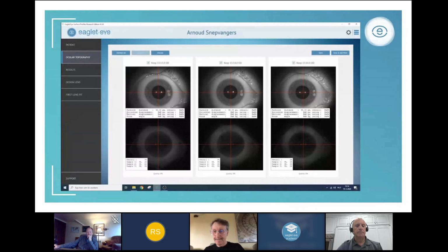Stephen Matthews asks, any indication about scleral molding from the fingers? I would say none at all, because we recommend using the orbital bone. So you grab the eyelashes and you really pull them down to the orbital bone. And at the moment that you start touching the eyeball, the sclera, the patient is moving back anyway. Very nice. Thank you, Reinier.